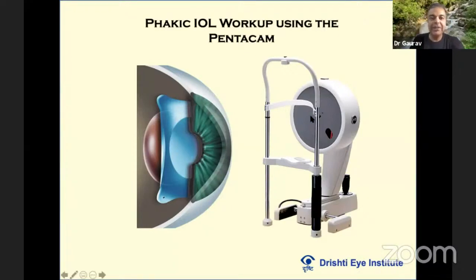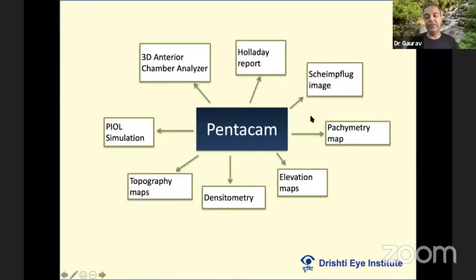We all understand that when we do a refractive surgery workup, we measure on many devices, as Dr. Namrata also mentioned, and Dr. Tityal sir and everybody else: don't rely on just one device or just one map. I really go crazy when people come with that one printout of a Pentacam saying, sir, this is my report. It's like seeing an ultrasound B scan report of one printout and trying to comment on that. I always end up telling them that I'll have to repeat it.